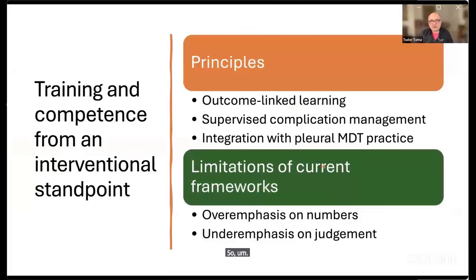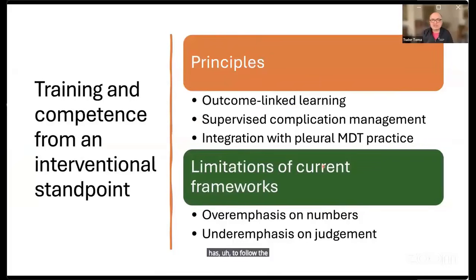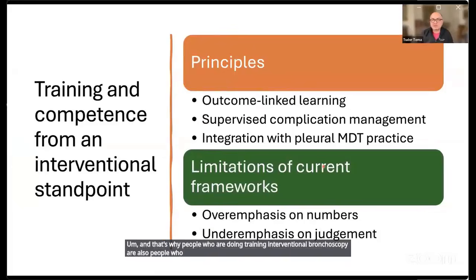So how do we do training? I think this is another important aspect, because training in thoracic ultrasound has to follow the same principle as training in interventional pulmonology. And that's why people who are training in interventional bronchoscopy are also people who are doing very good training in thoracic ultrasound.